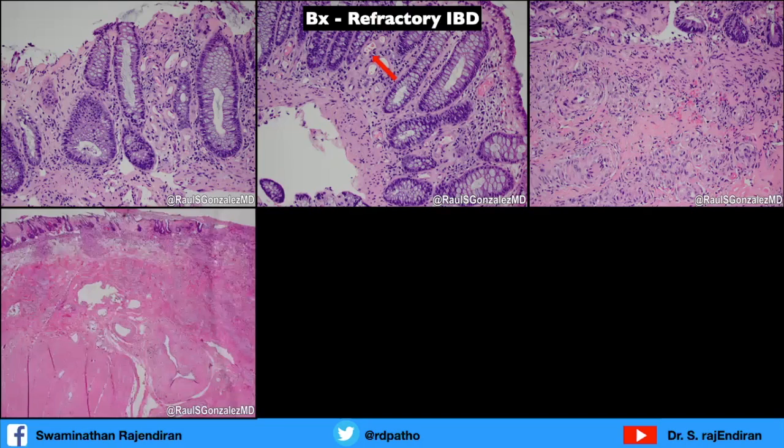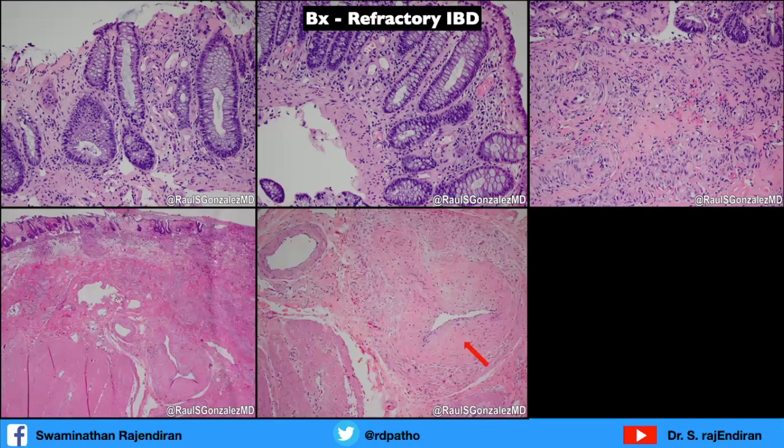They went for resection, and in the resection you see something like an AV malformation, isn't it? Thick and thin blood vessels of varying sizes are seen. In high power, you can see a very thick vessel wall with a narrowing of the lumen, whereas here it is relatively preserved. So you want to know whether it is a vein or artery.